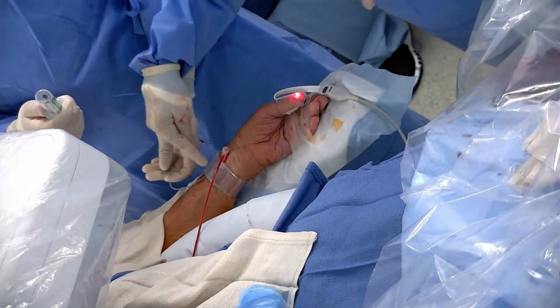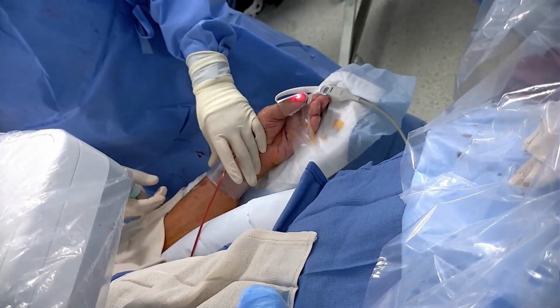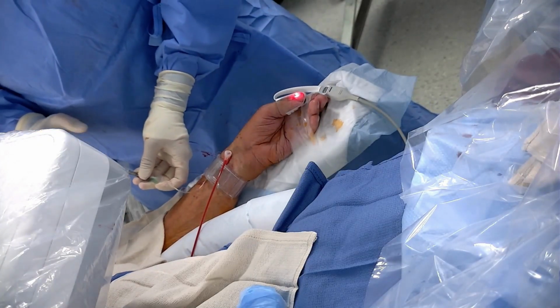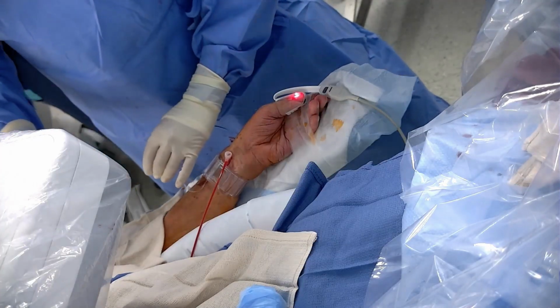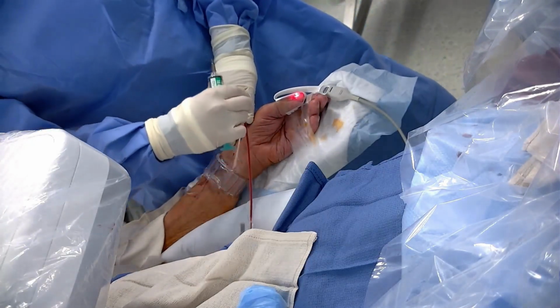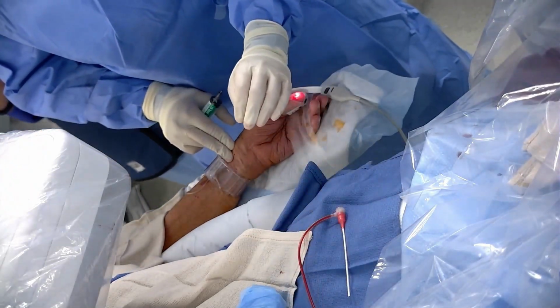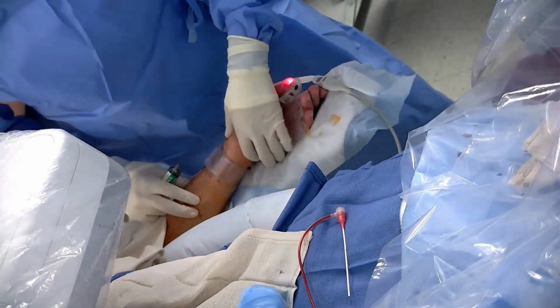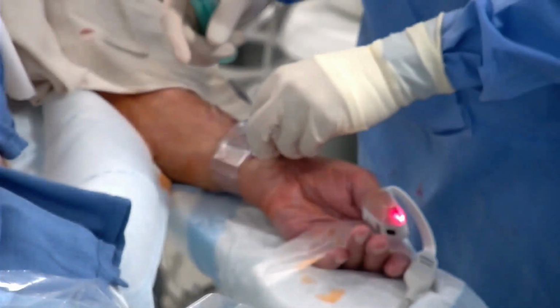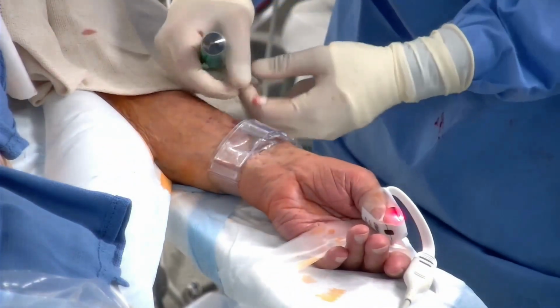So what he's done is he's put the green dot on the TR band over his entry point into the artery. It's a little hard to see, but there's a little green dot. And then he basically put the Velcro on as tight as he can, and then he injected about 20 cc's of air. Still have a waveform. Yeah, we still have a waveform here, so he's going to take out the sheath. It's a little hard to see, although you want the Q-tips. Sometimes when blood gets underneath there, it's a little hard to tell exactly if it's bleeding or not. So he's just cleaning underneath with a Q-tip here.